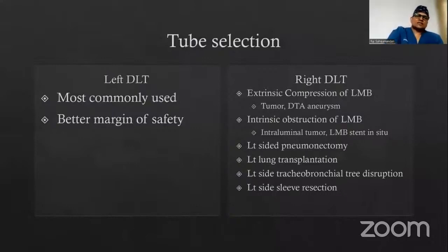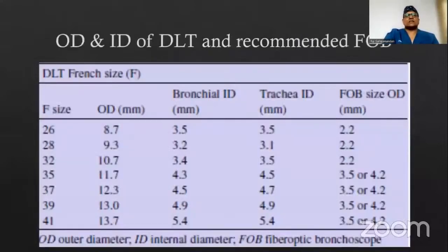So what I will say is that if you plan a right DLT for the first time in a critical situation, you may struggle. So when you get an opportunity, when you're doing a left-sided surgery and you have the fiber optic, go for a right DLT.